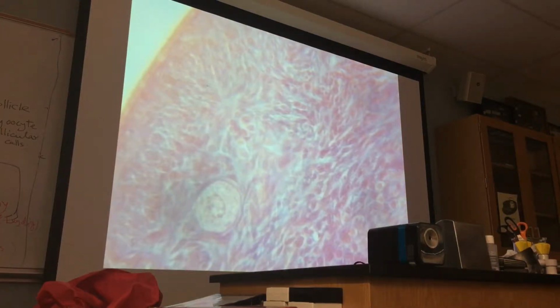Now, primary oocyte and primordial follicle, they're different things. Primordial follicle contains a primary oocyte. Look here, primordial follicle equals primary oocyte plus follicular cells. So where are the follicular cells? These are the follicular cells.